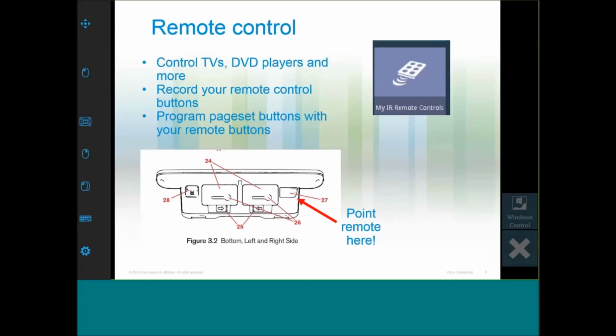There are built-in page sets for remote controls within both Communicator and SonoKey. The one in Communicator has smaller buttons that are all on a single screen. The one in SonoKey has larger buttons on a few screens.